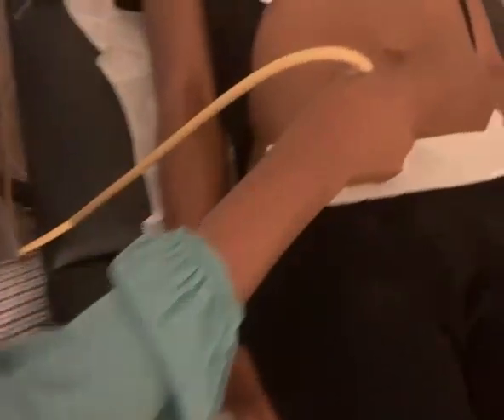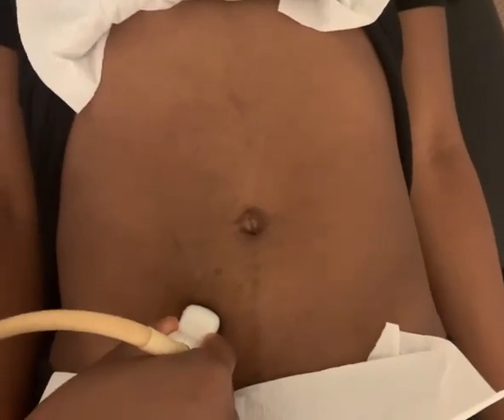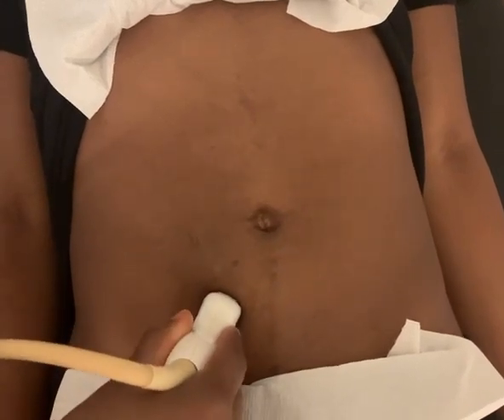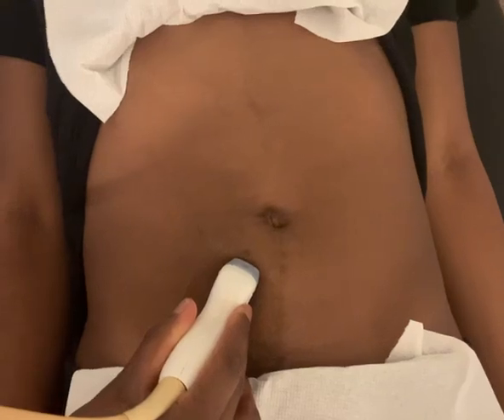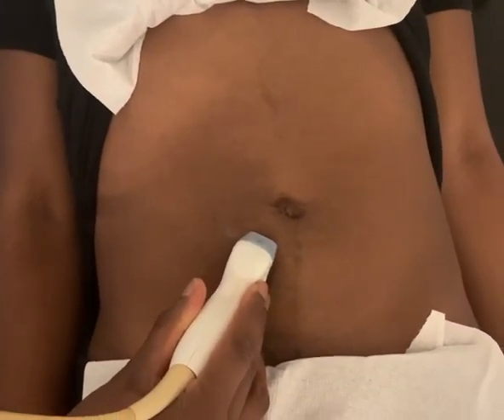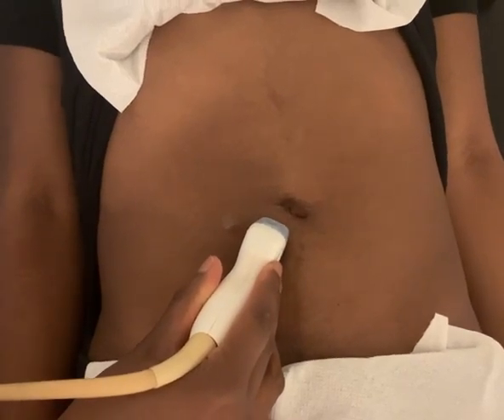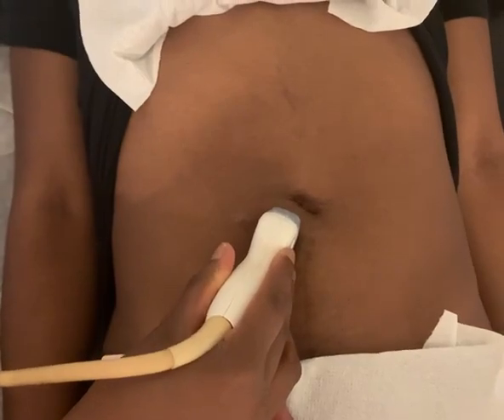Today I have a young model with me, and when you're looking at the common iliac artery, I always start at the groin. The reason is because I can image my external iliac artery and slowly rock my probe up towards the belly button. As I rock the probe up, I can image the external iliac, the internal iliac, and get up to the umbilicus where I can see my common iliac arteries and also the distal aorta.